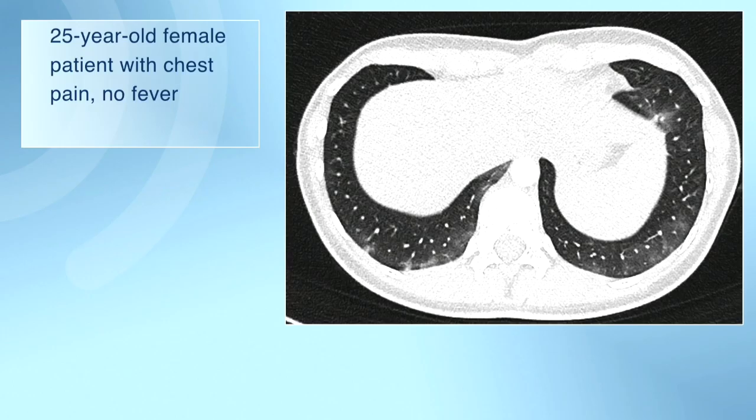So let's walk through this case. This is a patient from last week, actually, a patient who came in with chest pain, and she had also a low lymphocyte count. However, she was not suspected to have a COVID-19 infection, so she went to our CT scanner. And what you see here are very typical findings.